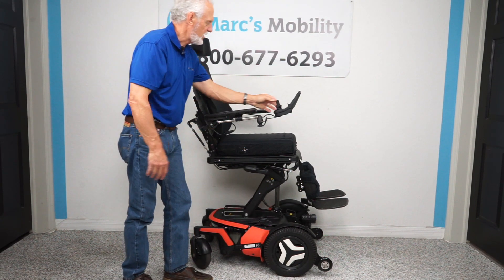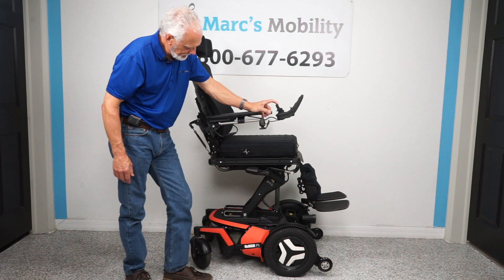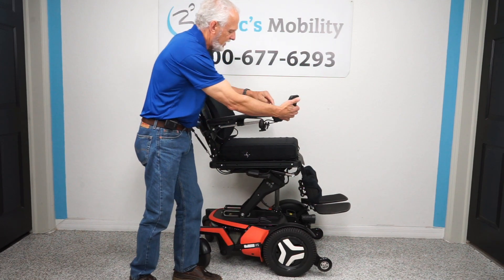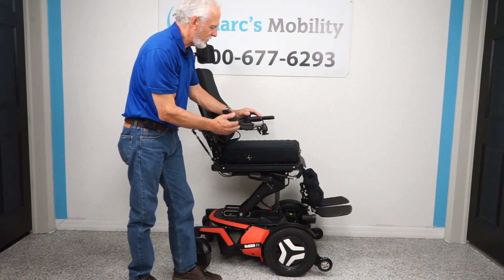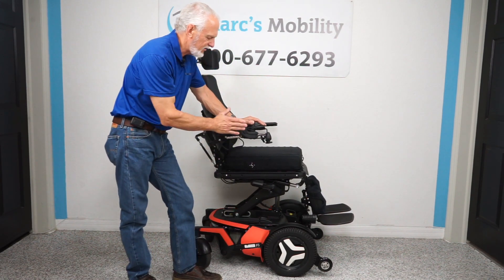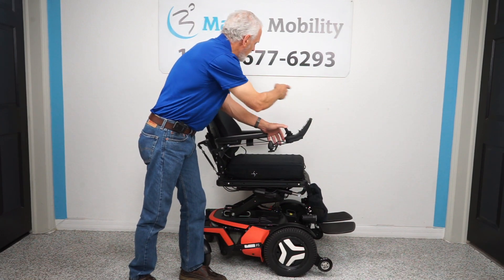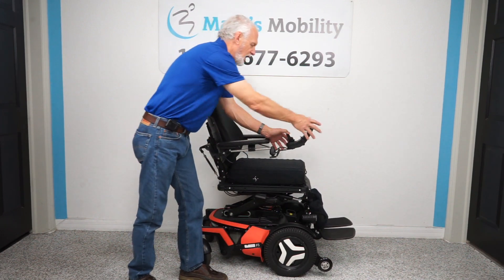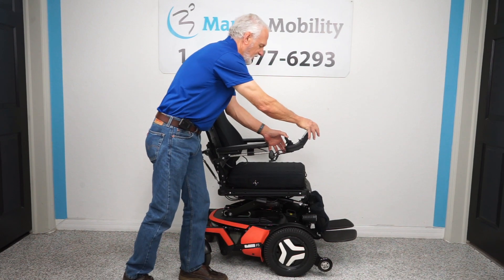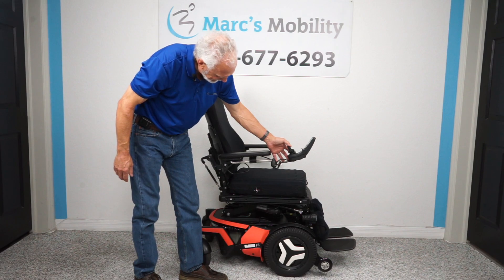We're going to turn the power back on, give it a second to reset, and go back to the seat function to bring the seat back down. You also have what's called a swing-away joystick — so if you get to a dining table and want to get close without damaging your joystick, it swings away. If you're left-handed and want the joystick on the left side, that's no problem — it'll swing to the left side. We're almost all the way back down.